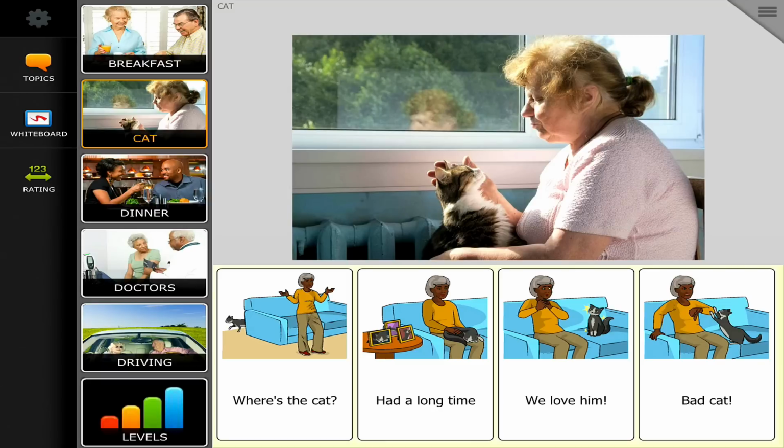So now I'm on the stroke and brain injury persona page set, available in the Compass app. This one is specifically for individuals with stroke or brain injury, and they've developed it based on current research. What it has available within it is a range of communication tools that are provided for total communication support.